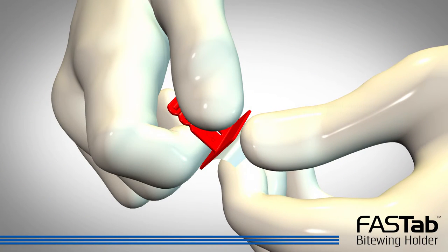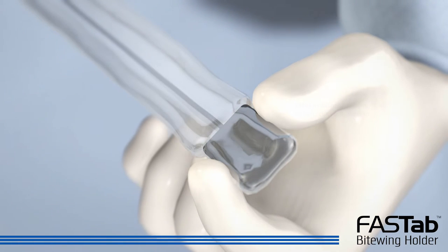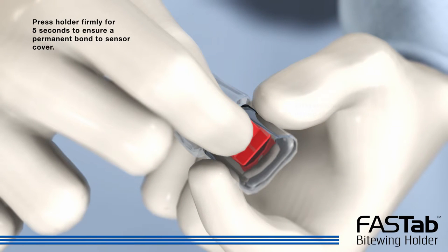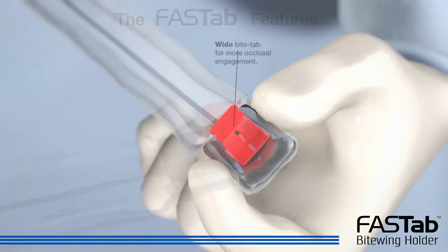Remove the plastic backing from the FastTab sensor holder. Attach the holder onto the sensor cover in the correct orientation for either horizontal or vertical bite wings. Press the holder firmly for five seconds to ensure a permanent bond to the sensor cover.